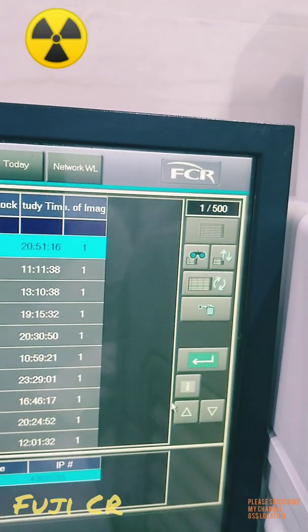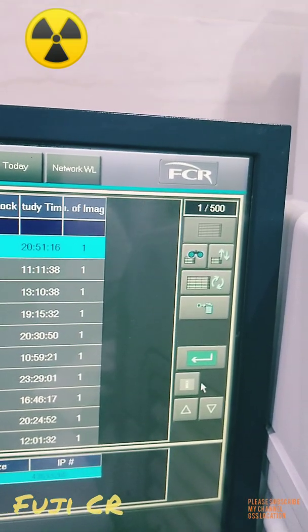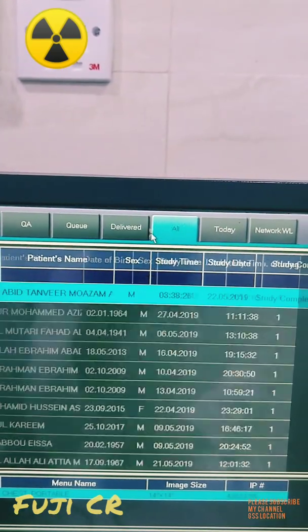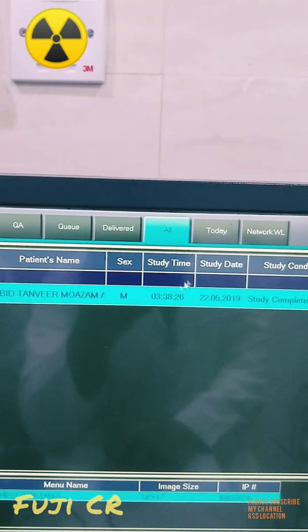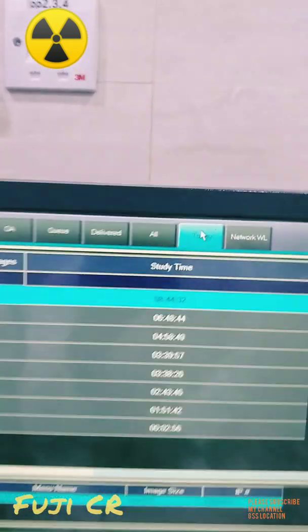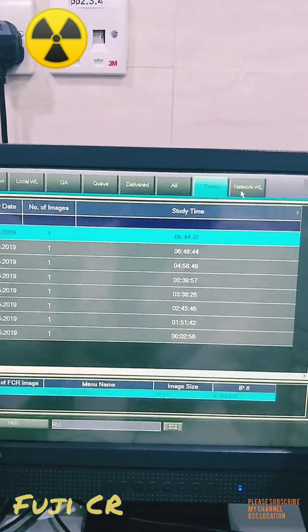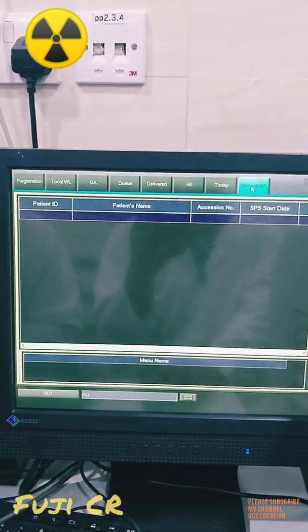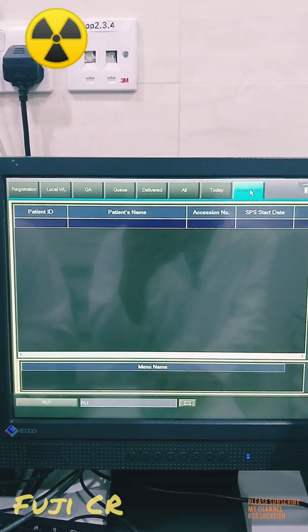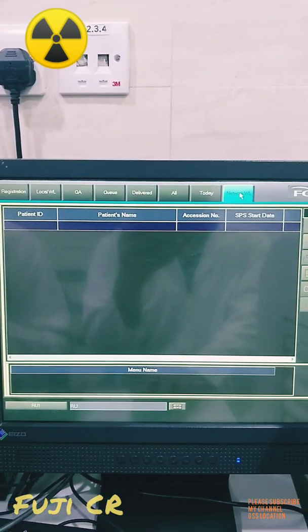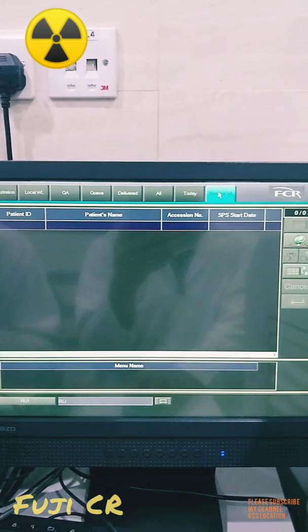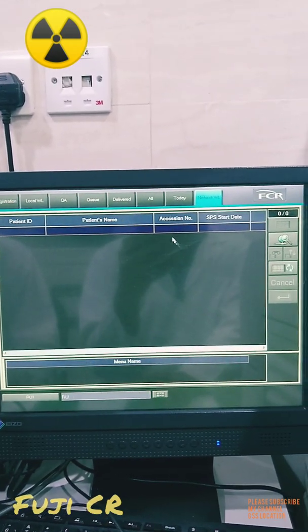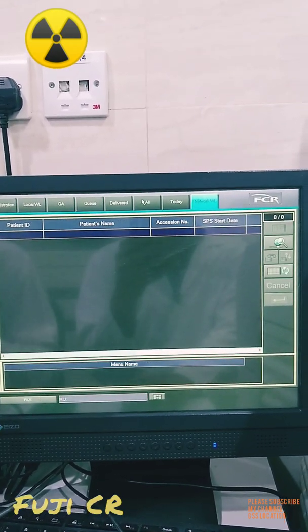There are multiple search options — you can search by patient ID or patient name. There is also a sort option: you can sort by today, yesterday, and so on. You can also filter and check by date. Now I am going to show you mainly how to transfer the image.